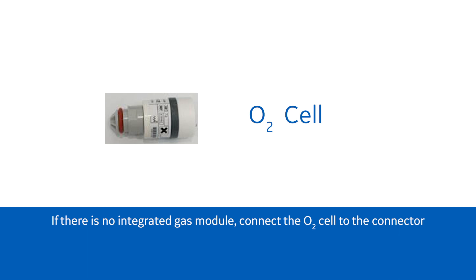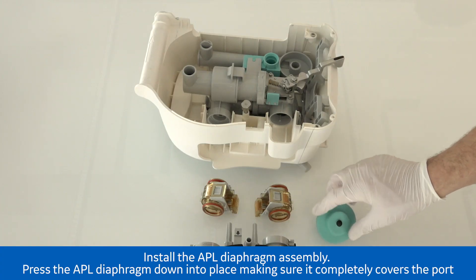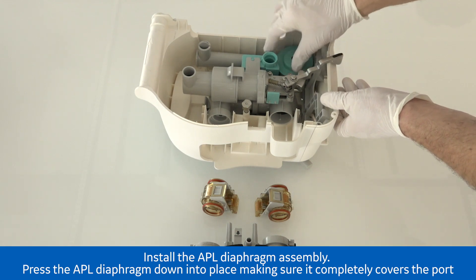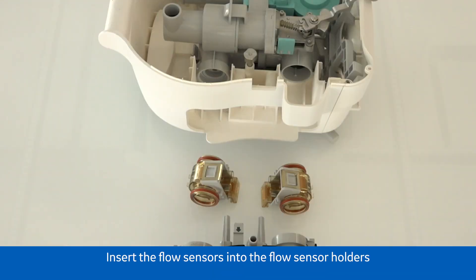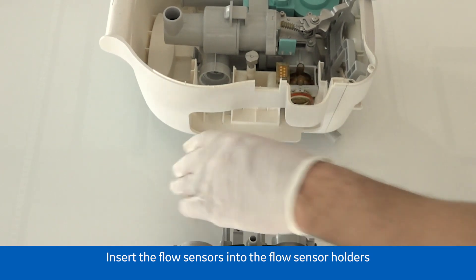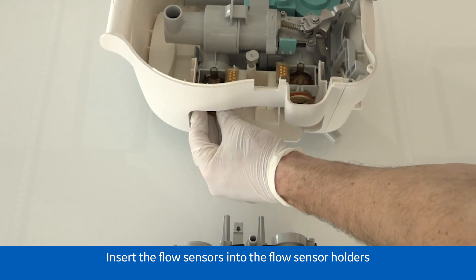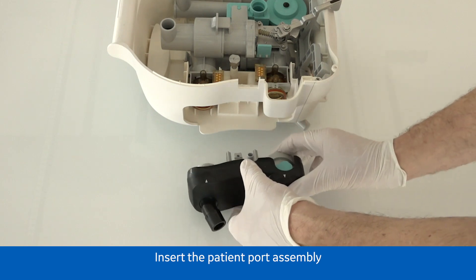If there is no integrated gas module, connect the O2 cell to the connector. Install the APL diaphragm assembly — press the APL diaphragm down into place, making sure it completely covers the port. Insert the flow sensors into the flow sensor holders. Insert the patient port assembly.